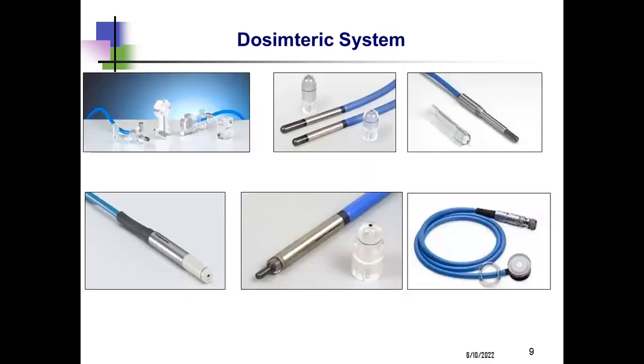These are the chambers. For example, we have holders of the chambers, thimbles. This is the Semiflex, Farmer chamber, dosimetric diode chamber, pinpoint chamber, and we have the Markus chamber.